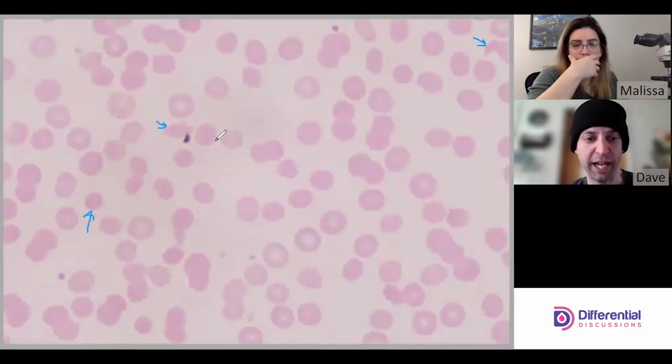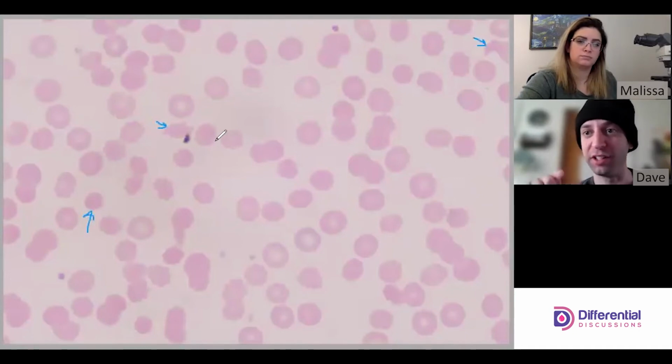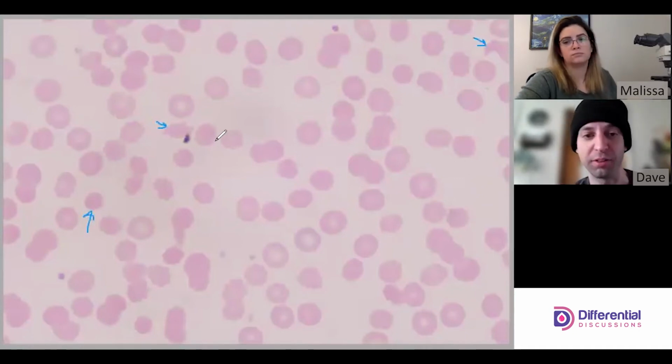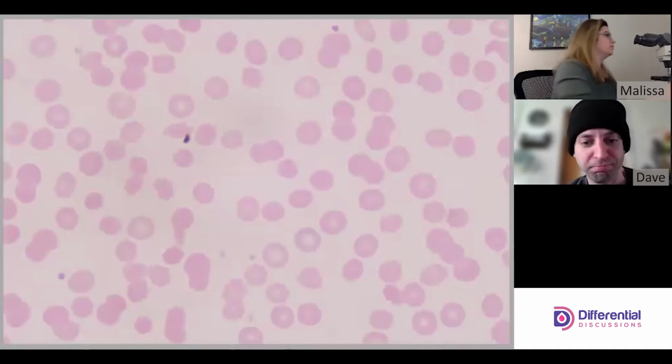Yeah, and we have another video on acanthocytes, but just for the sake of convenience, acanthocytes would have uneven projections, contrasting with an echinocyte that's going to have evenly formed projections throughout the periphery of the cell. Yeah. Yep. But still, just one, right? Yep.